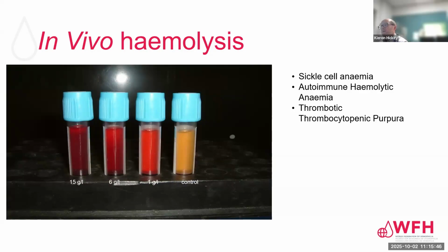But it's also important to remember if the patient has sickle cell anemia, autoimmune hemolytic anemia, or TTP, there may be occasions where you do need to test this sample. So a pragmatic approach is required.